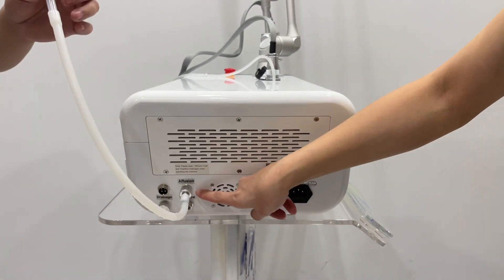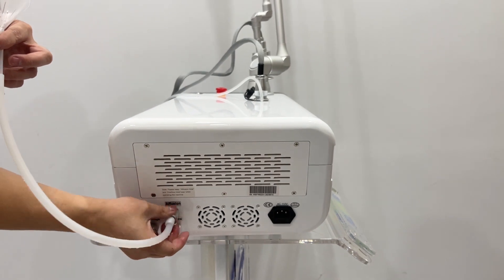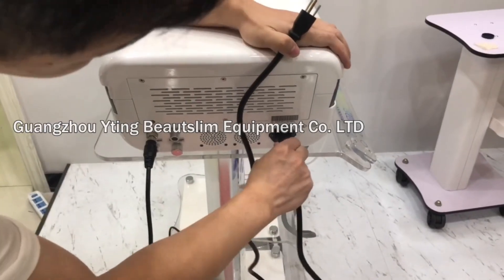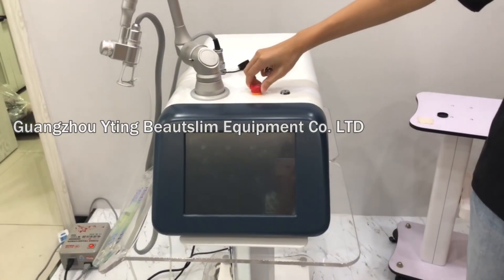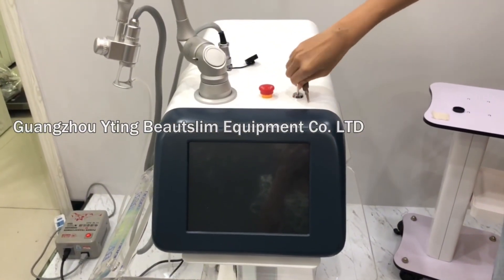Keep these two holes open when using the machine. Connect the power cord. Rotate this button. Connect the key and rotate the key.